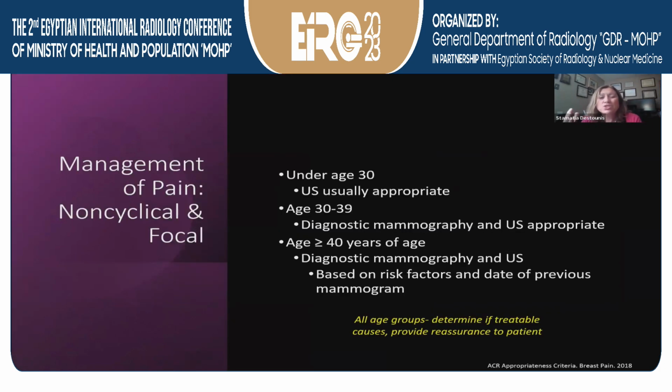So how do we manage it? The management of pain, if you're under 30, we'll start with ultrasound. If you're 30 to 39, we may start with the diagnostic mammogram and ultrasound. Obviously over 40, we're going to do a mammogram and an ultrasound.